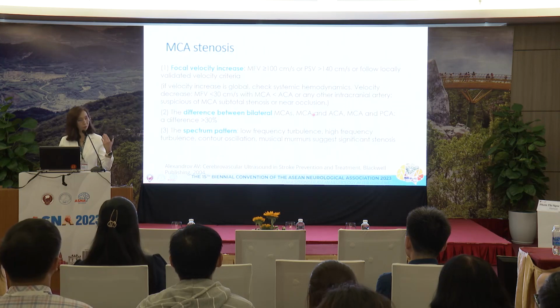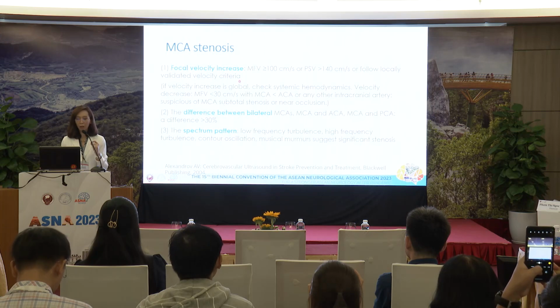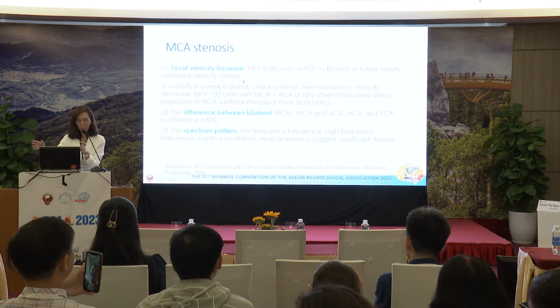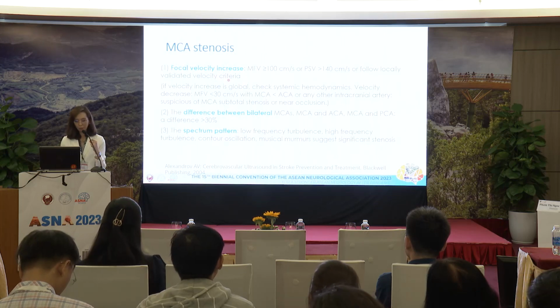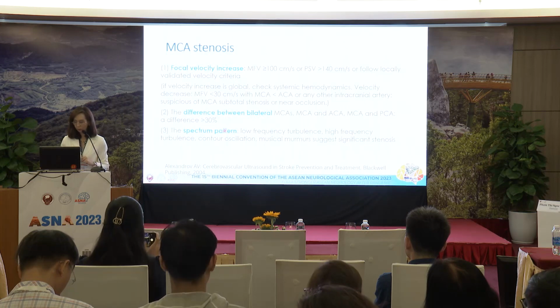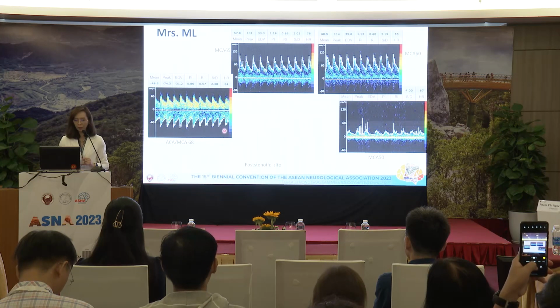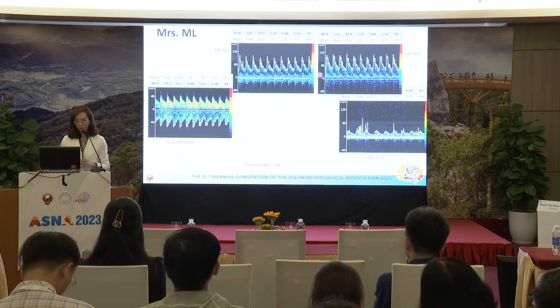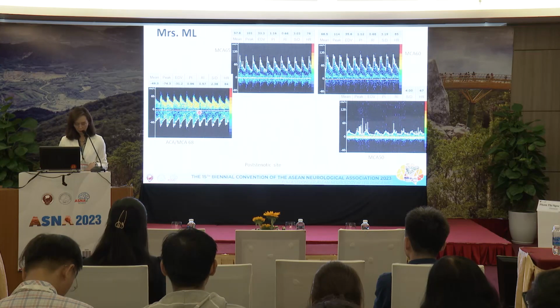There are some criteria, and Romani has mentioned some of them. What we expect is to have focal velocity changes, right? If the velocity is the same at all depths, it would be normal, or maybe no focal stenosis. But if you see focal velocity changes, it's very likely that it's a stenosis, right? And this is what it looks like when we perform TCD on the patient that we are having. So this is at a depth of 65 of the MCA here, depth of 60, depth of 50, and this is 68. What do you think?